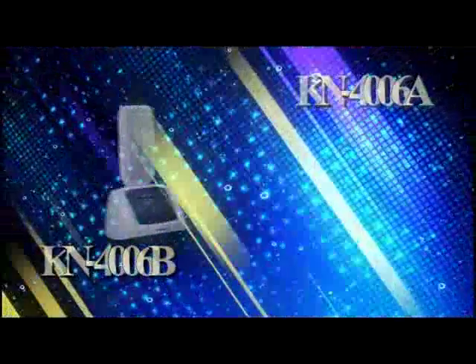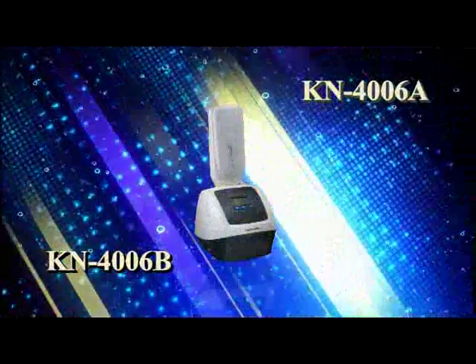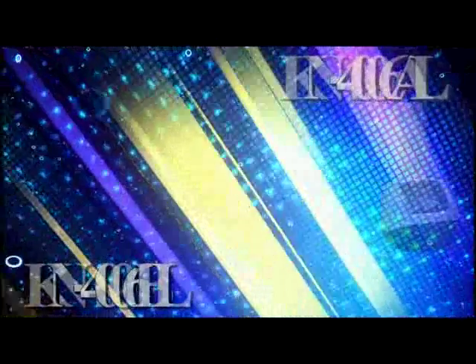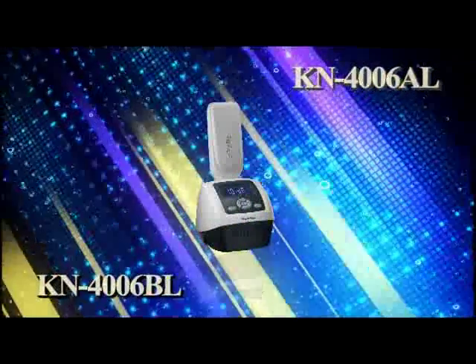This video is only for KN4006. The video can help you correctly use the instrument. The copyright of the video belongs to Kernel, and it is prohibited to copy.